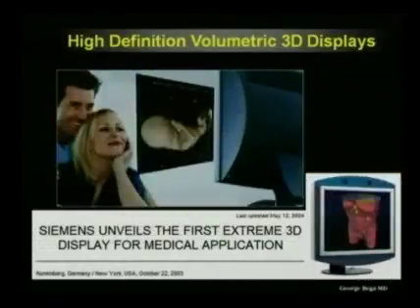In this particular image, you will see true volumetric displays. We are not yet capable of visualizing our volumes on volume displays. Our displays, even though we're dealing with volumetric objects, are still flat. True volumetric displays are available in medical imaging, but they're very expensive.